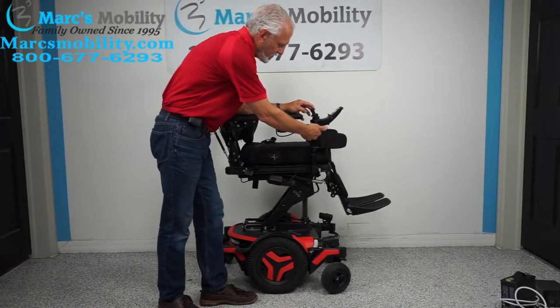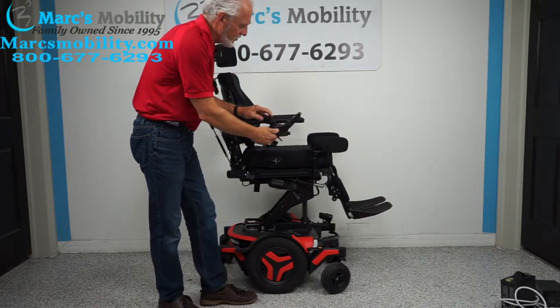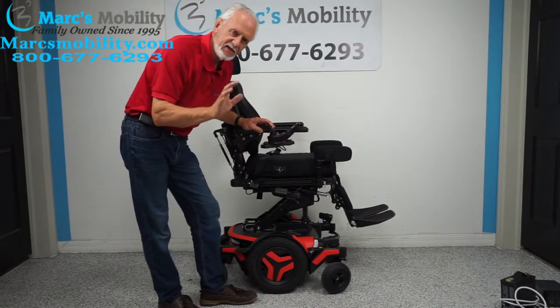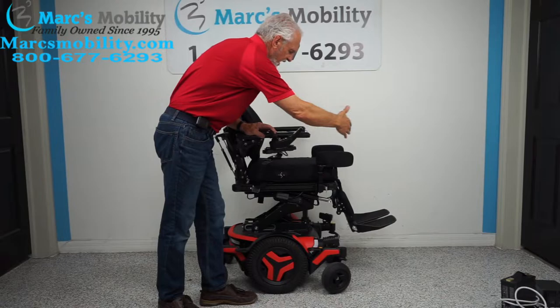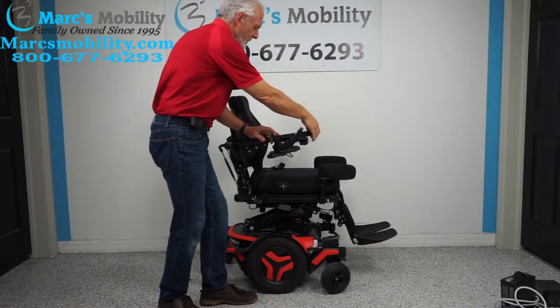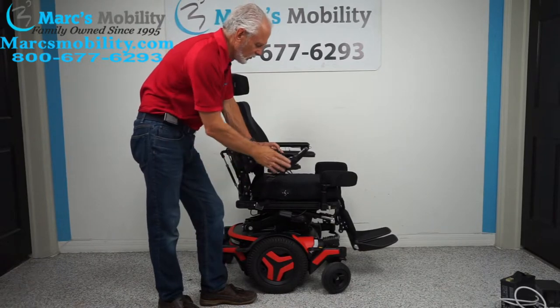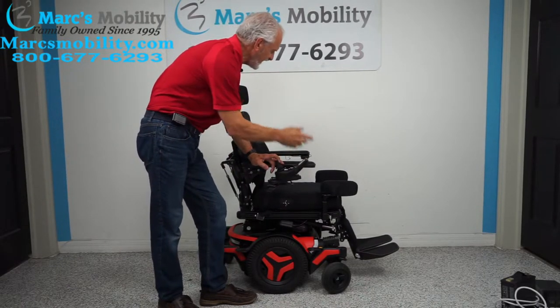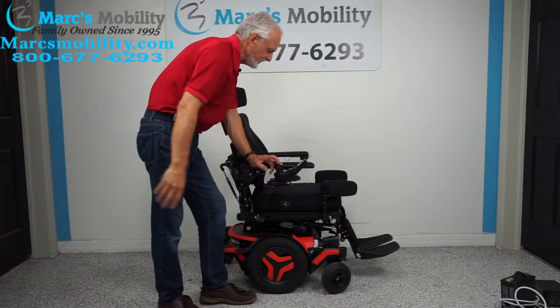This is a swing-away joystick — notice how I took it from here and brought it over here. This enables you to get a lot closer to a dining table without having to raise the arm. If you're left-handed, we can put the joystick on the left side and it'll swing to the left side.